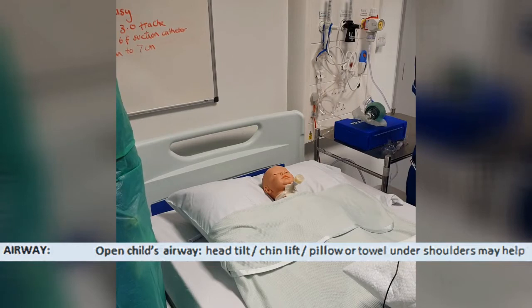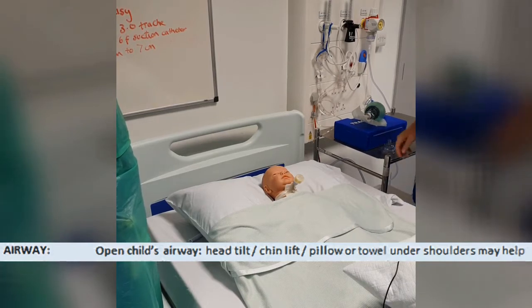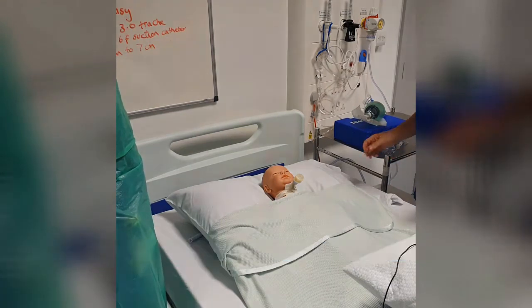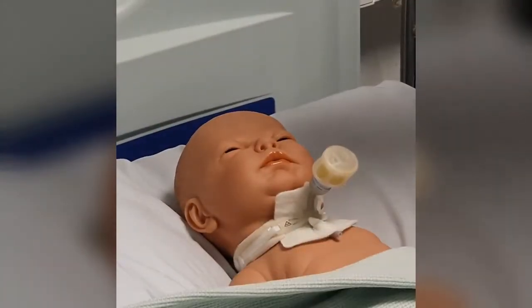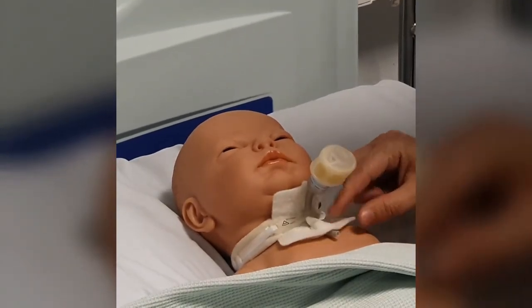So the next stage on the algorithm is to open the child's airway. But something that I think is particularly important is to check that the tracheostomy is actually in. What can happen is it can flip out, but that is hidden by the dressing. So for example, if we come to Daisy and lift up her dressing now, her tube is actually out, but that wasn't initially visible.